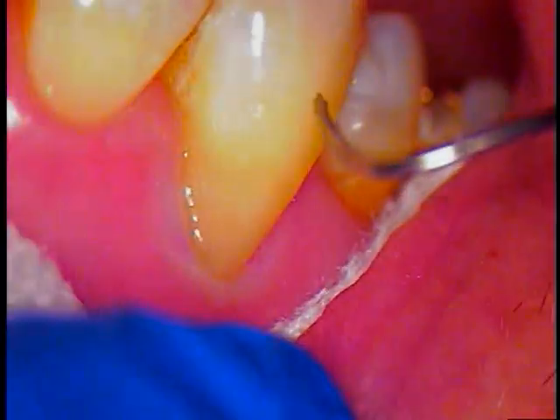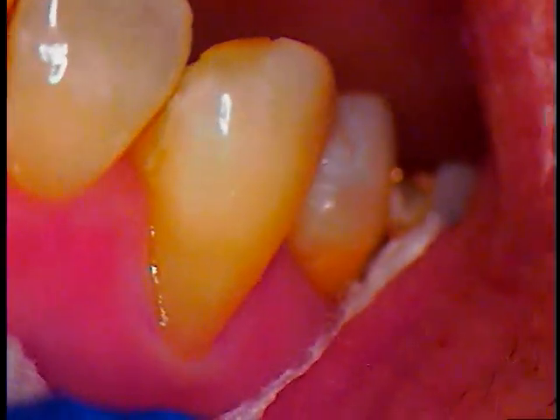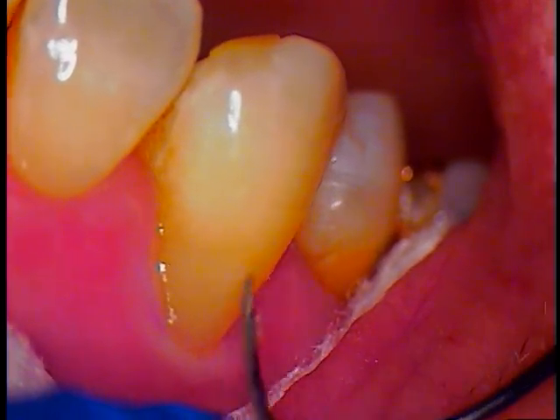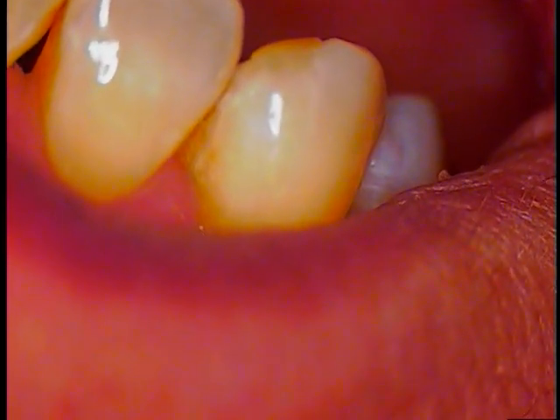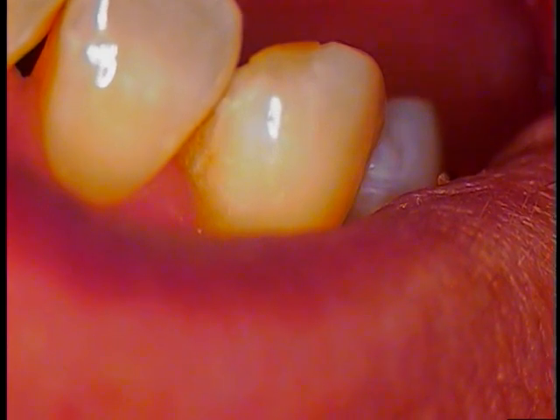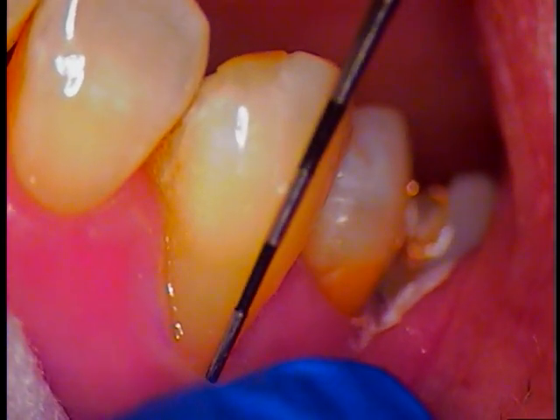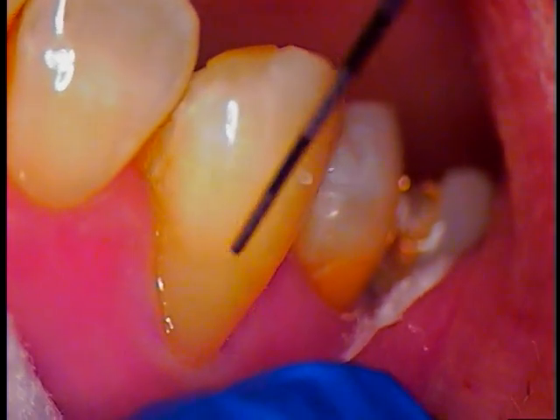Okay, so that's it. We'll bring up the light now, take a look at our tooth, and see the beautiful transition now coming from the enamel all the way through the dentin. So we don't have one color, but we have a transition of colors, and that's what you want. You want that to fade in, and you don't want it too over contoured at the neck. You want a little S contour, a little reverse negative contour from a zero emergence profile, so you're not completely making that totally round. It's an S contour.